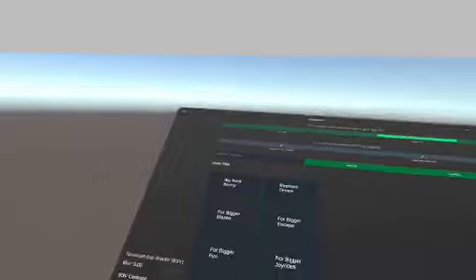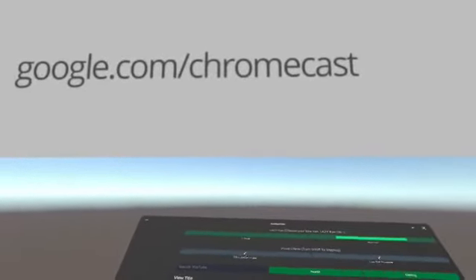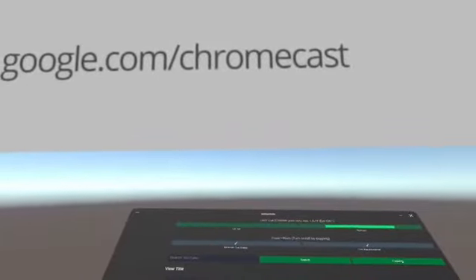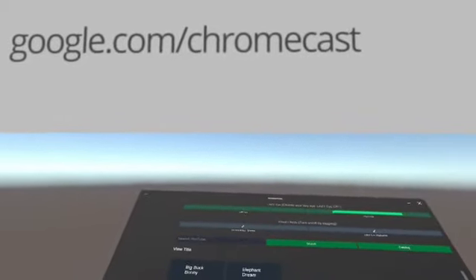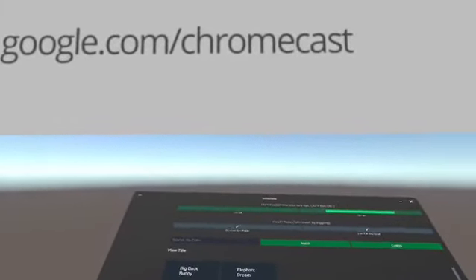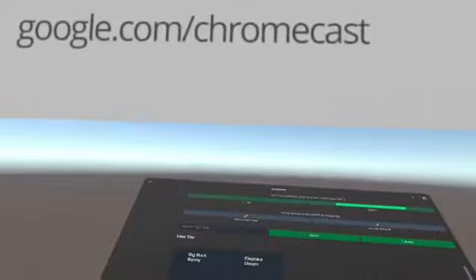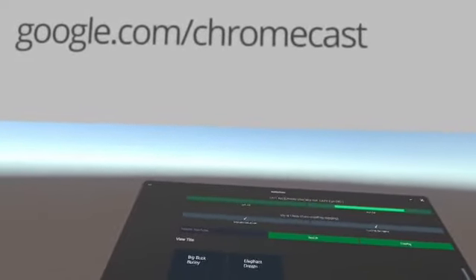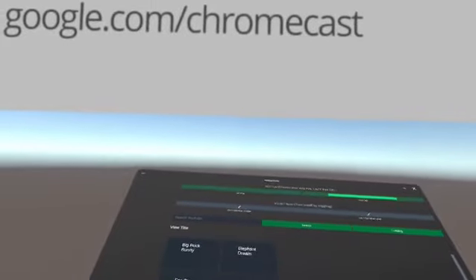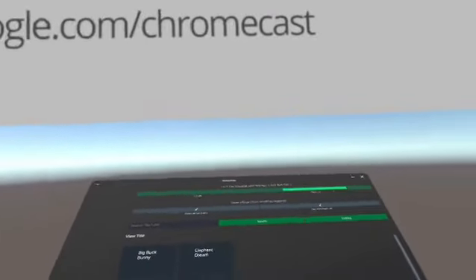Okay, if you activate your dominant eye to a limited capacity wherein you add some kind of blur to it, then it starts working with your lazy eye, and it is very important that it should work with your lazy eye. Okay, both the eyes should work together, because depth perception only happens when both the eyes work together. Okay, if only one eye is working, then the depth perception never comes. Okay, and this is a key problem for patients with amblyopia. Okay, they should work with both the eyes. So this is all about it, and you can use Amblyotube.